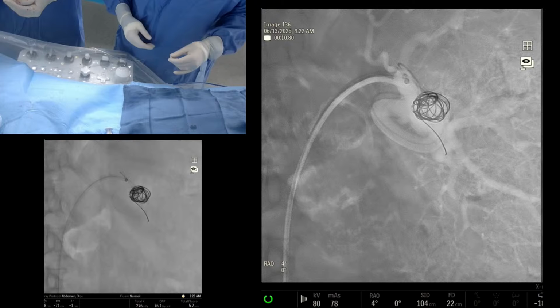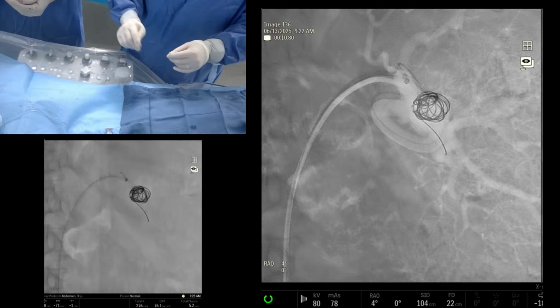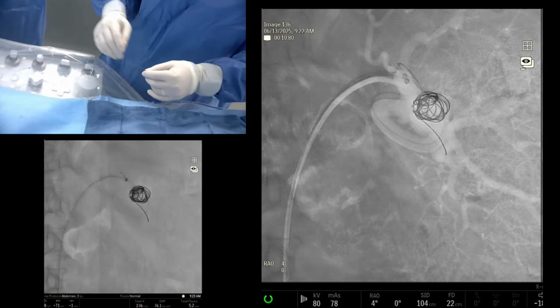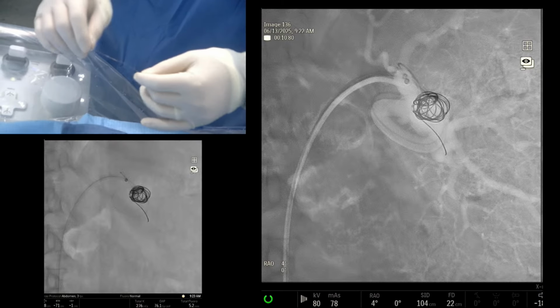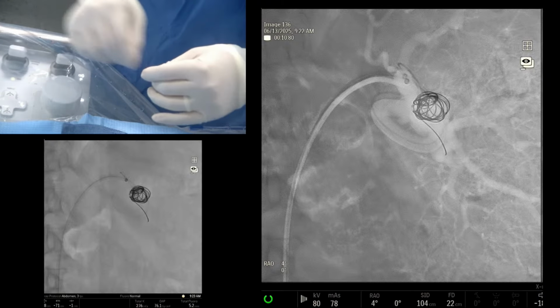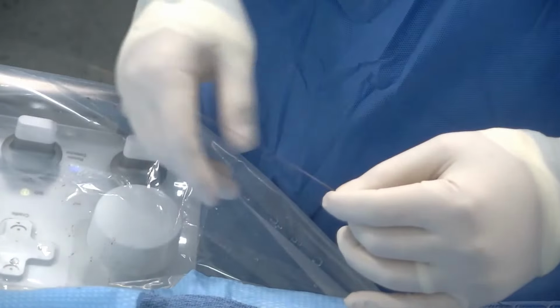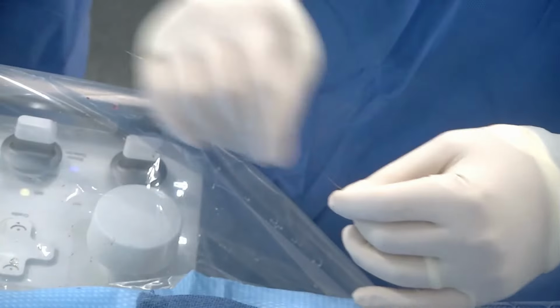This is a nitinol pushing system, so it works quite well around the tortuosity, as both of you had mentioned, and it won't kink, which is sometimes a source of consternation for some people. I assume the camera is at my hands. With nitinol, you can really bend it back and forth, and it won't kink. Sometimes with the older platforms with the steel mandrel, you'll be pushing against some tortuosity and it will kink, and that really limits the ability to push through. So this is quite nice.